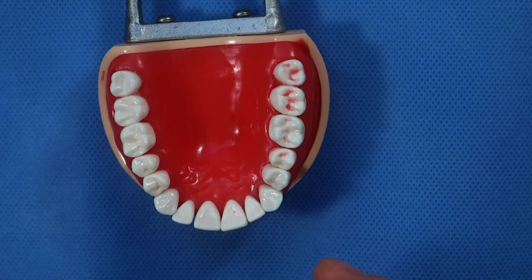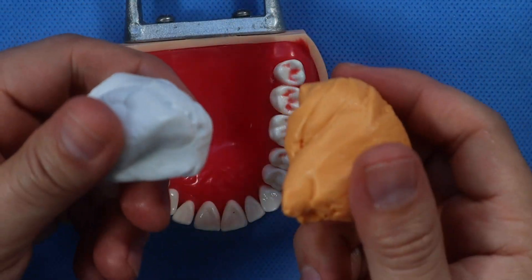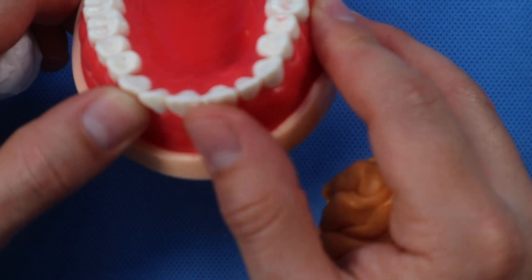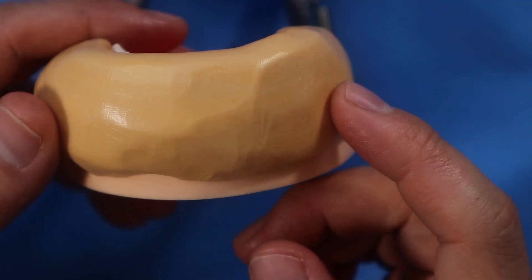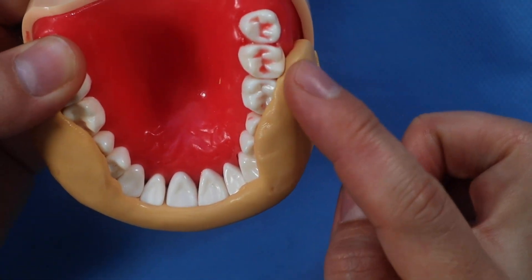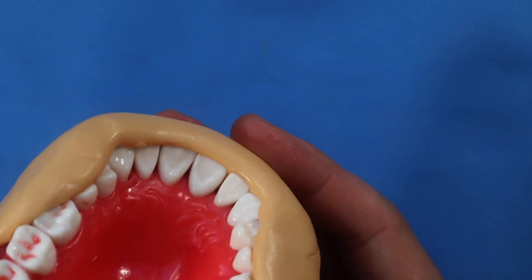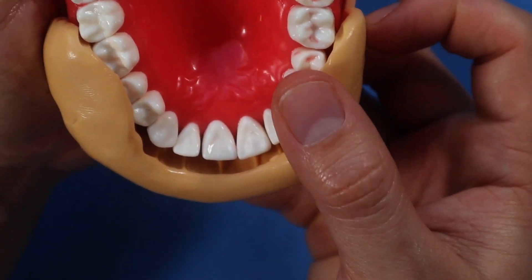Before you extract the tooth, you're going to take some putty, mix it up, and make a matrix of the facials of these teeth right here. Here's the putty from the facial, indexing the facial aspects of those teeth. See how I went over the occlusal aspects back here and captured the incisal edge but didn't go to the lingual. Now we have a position matrix for the anterior teeth.